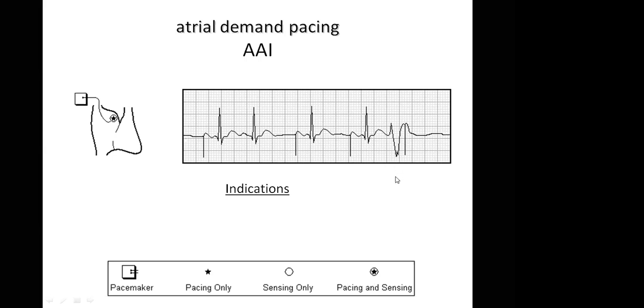Okay, sorry, now let me ask this question. If we go back to the first spike on this picture, is it on a T wave? Yes, it's on a T wave. Okay, the first spike is on a T wave. It looks like a T. Then you can see it's as if the P wave is entering the QRS complex.